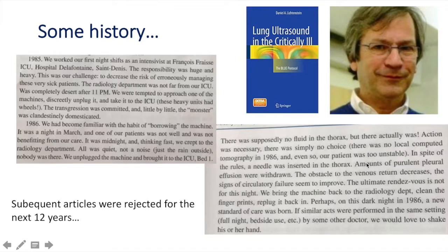In spite of the rules, a needle was inserted in the thorax. Amounts of purulent pleural effusion were withdrawn. The obstacle to the venous return decreases. The sign of circulatory failure seemed to improve. The ultimate rendezvous is not for this night. We bring the machine back to the radiology department, clean the fingerprints, we plug it back in. Perhaps on this dark night in 1986, a new standard of care was born.